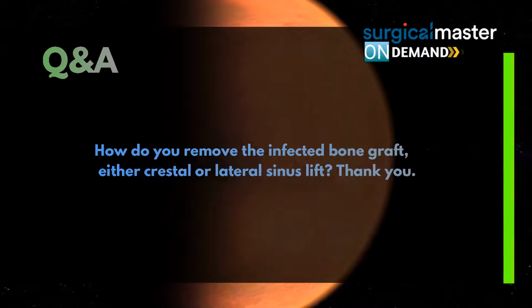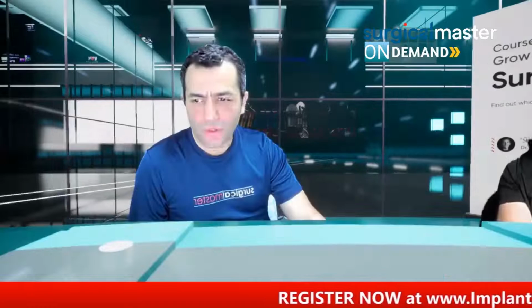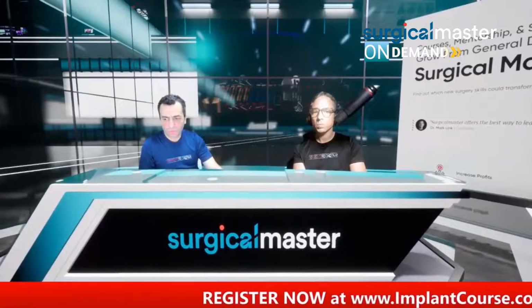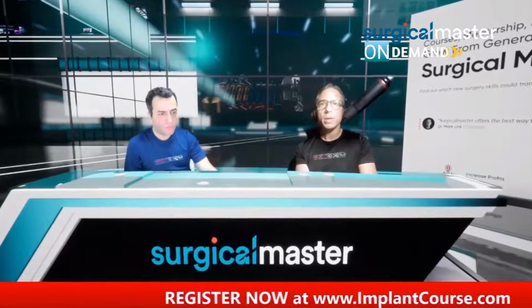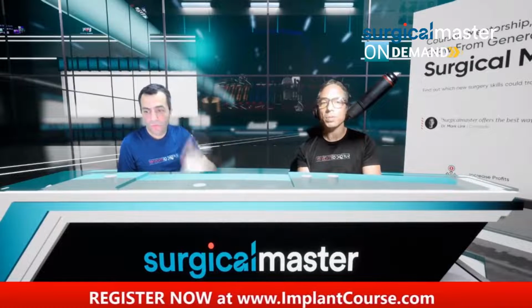How do you remove the infected bone graft, either crestal or lateral sinus lift? You kind of just explained that, Ziv. Do you want to add anything to it? No, same way. The way the bone went in, that's the way you take it out to clean the infection.